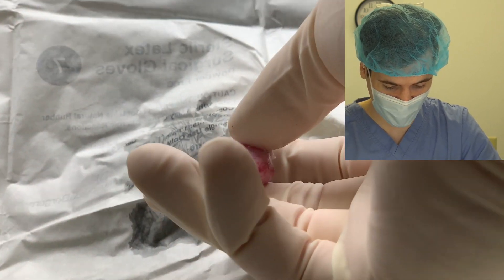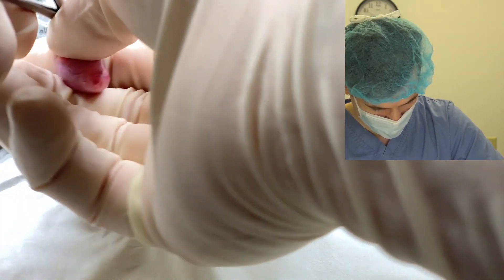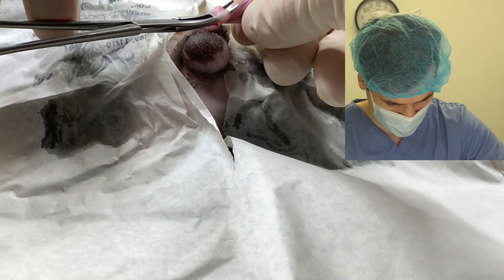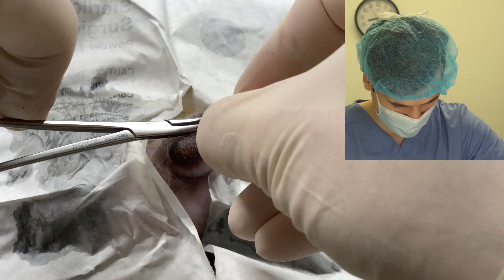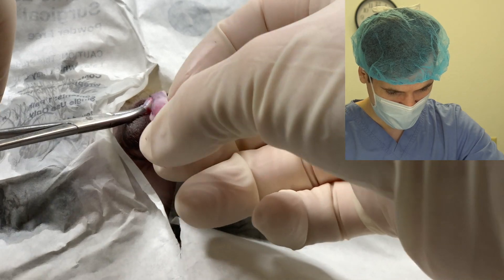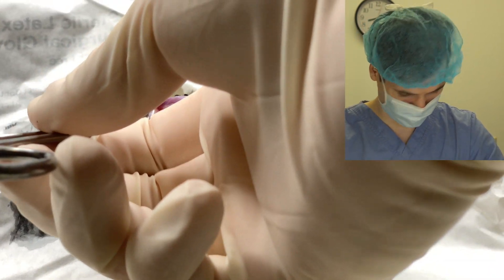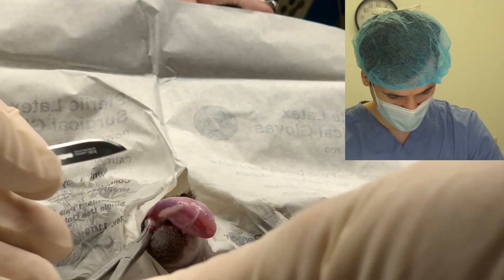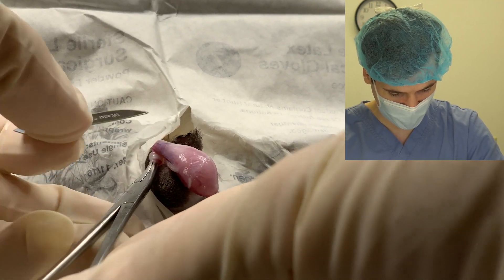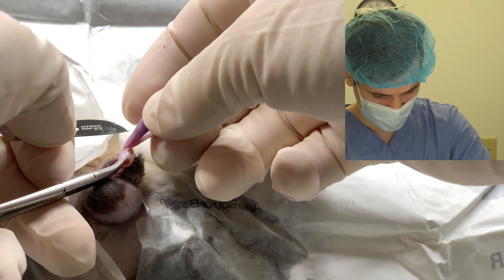Now I'm gonna make a simple tie around this testicle because there's blood flowing through here — arteries and veins — so we have to tie that off. I'll make a little loop, come around and grab it like this, and now that's clamped off. I'm gonna take my scalpel blade and cut off the testicle. The most important part is you don't want to cut off this little ring of tissue right here, because that's gonna mess up the whole procedure. We're just gonna cut off that testicle.